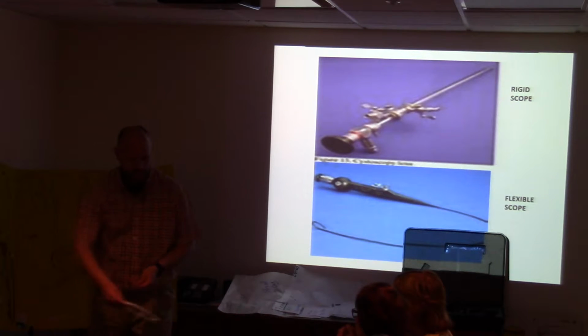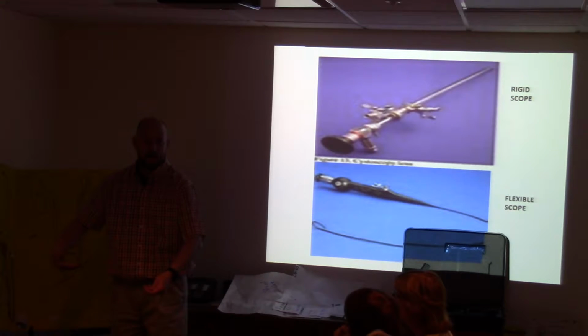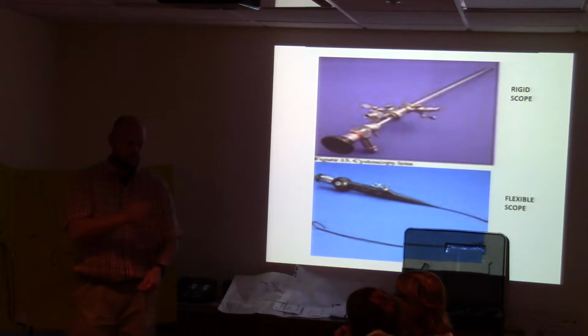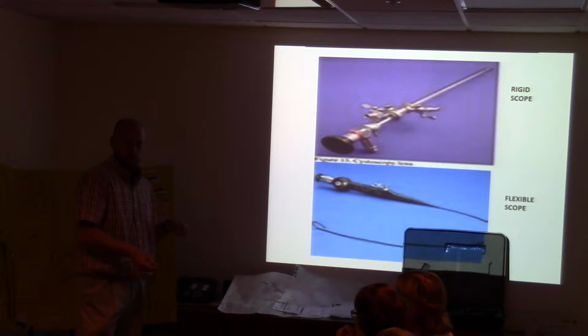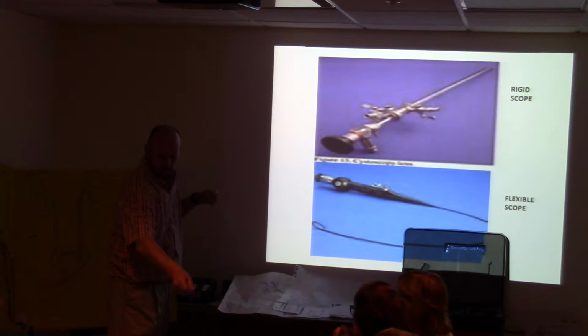And then there's this much sticking out of the back, and you know, everyone's sterile, they have sterile gowns on, you don't want this touching the floor or anything else. So they actually have an assistant with sterile gloves on, or patient care techs, or a scrub tech in a hospital, and they'll hold the back end of the wire so it doesn't flop around. So the doctor has the scope, and he's manipulating the wire, and he gets it where he wants it.